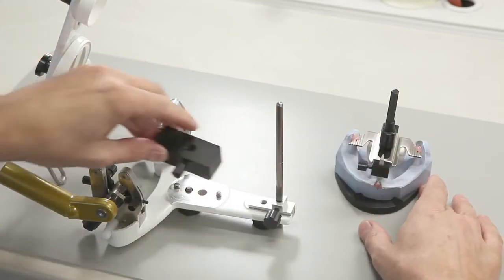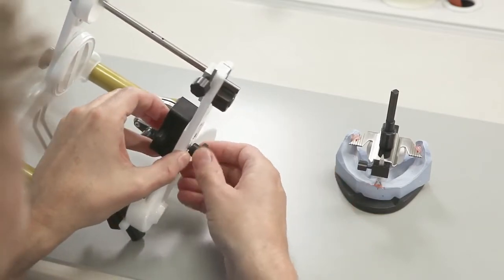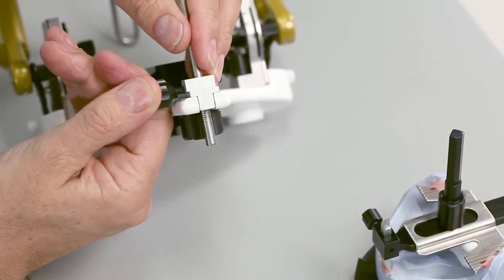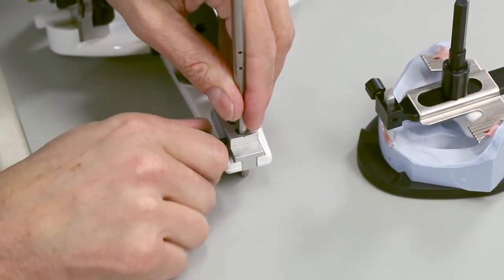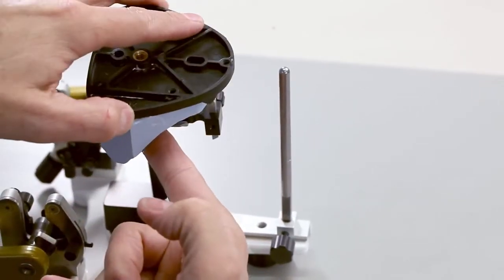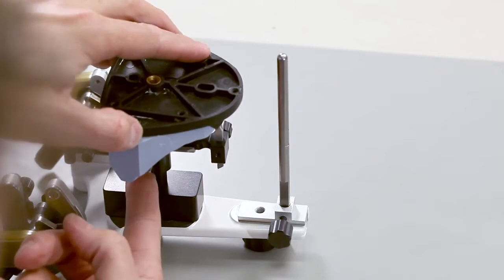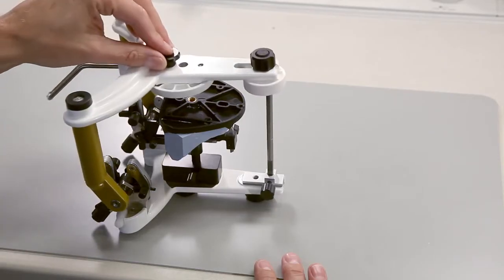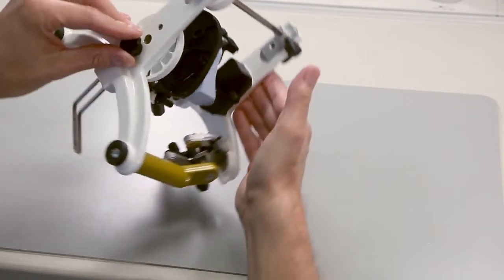Mount the instrument carrier in the upper frame base and fasten it with screws. Align the incisal guide rod to the red mark and secure it. It is now in the initial position. Insert the horizontal guide completely into the instrument carrier and secure it. Articulate the models in the usual way, with or without a split cast system.